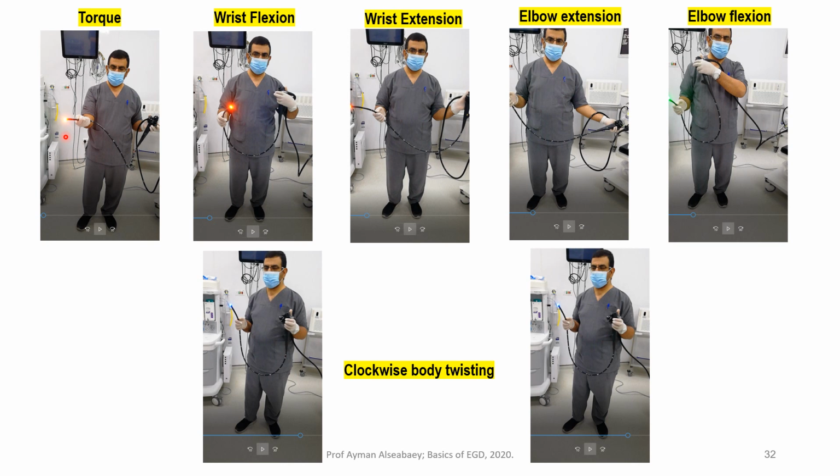If you rotate the endoscope clockwise, the endoscope in your screen will be directed rightwards. If I twist, if I torque the endoscope anti-clockwise, you will find that on the screen, the endoscope will go to the left. This is the first movement to avoid using the dials, okay? The second movement is through wrist flexion. If you flex your wrist, the endoscope will go to the right. If you extend your wrist, the endoscope will go to the left, okay?